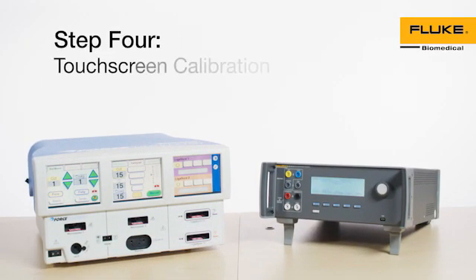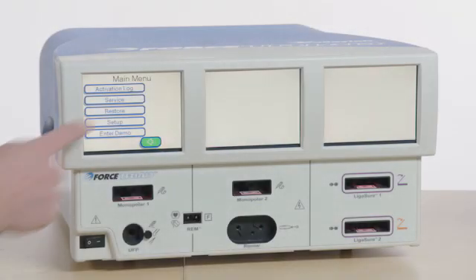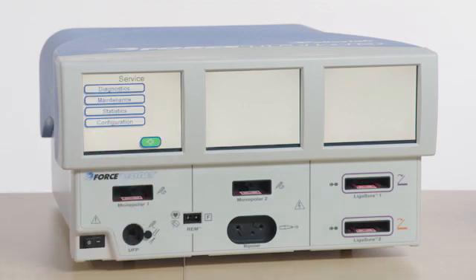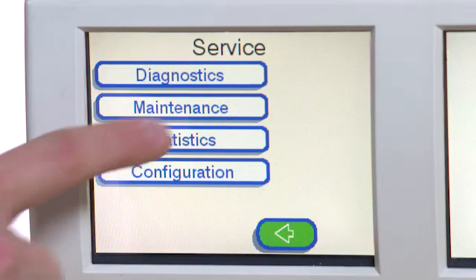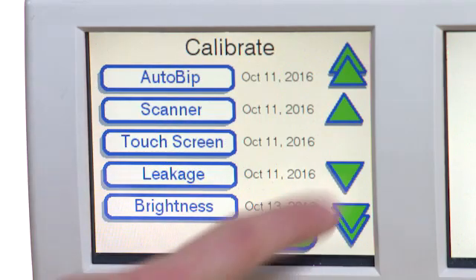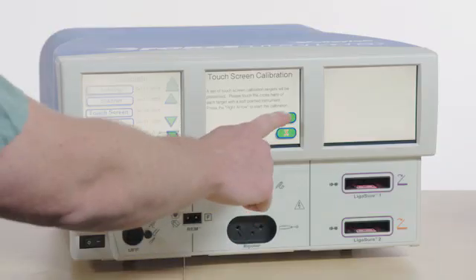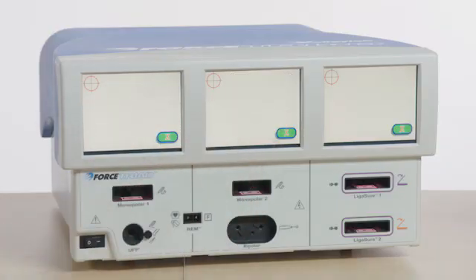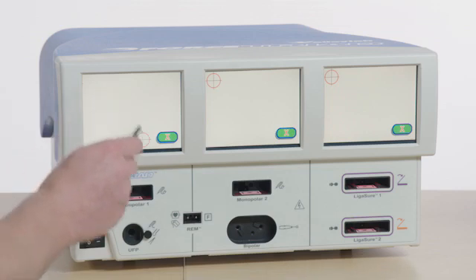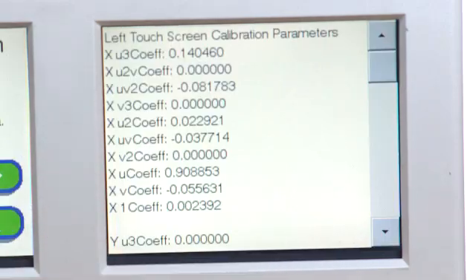Step 4: Touchscreen Calibration. Select Service. Enter the password provided in the Manufacturer Service Manual and press Enter. Select Maintenance and then Calibrate. Scroll the Calibrate menu list and select Touchscreen. Using a stylus, touch the center of the crosshair targets. Complete all targets, starting with the left side of the screen and moving towards the right.